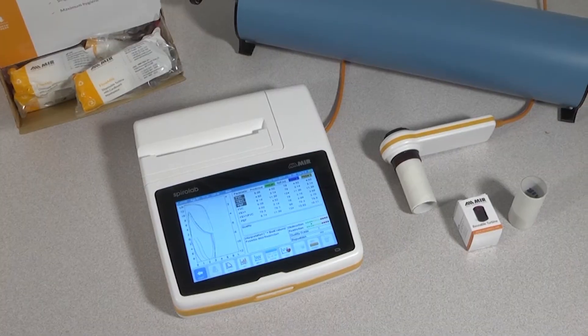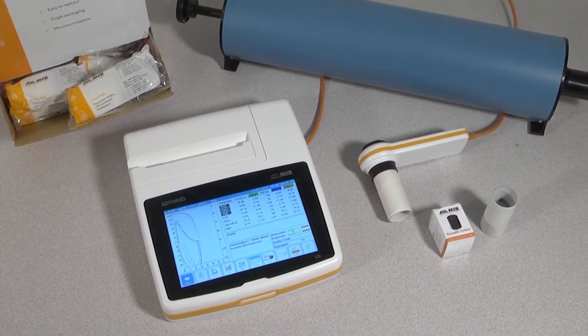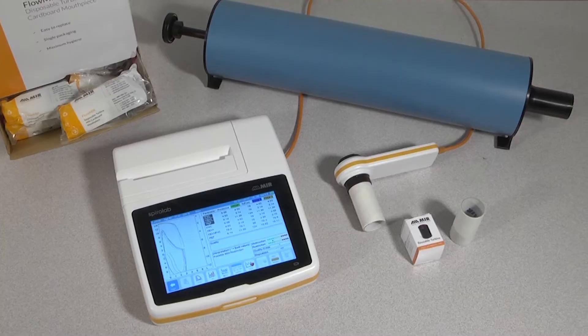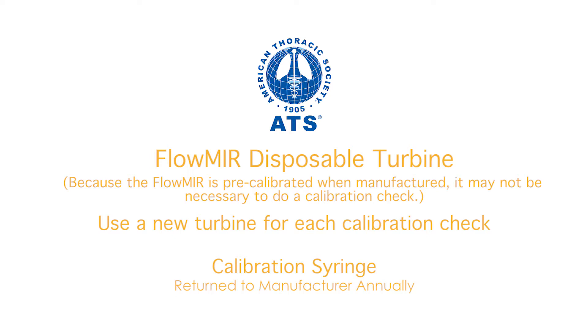To do the calibration check, you will need the MIR SpiroLab spirometer, an MIR reusable turbine or the Flomir disposable turbine, and a 3-liter calibration syringe. The American Thoracic Society recommends that when using a disposable turbine, you use a new one for each calibration check. Remember that the calibration syringe needs to be sent back to its manufacturer once a year to be checked and recalibrated for accuracy.